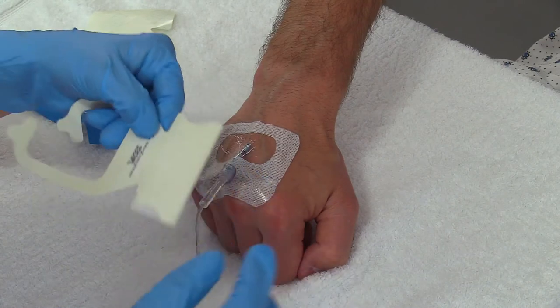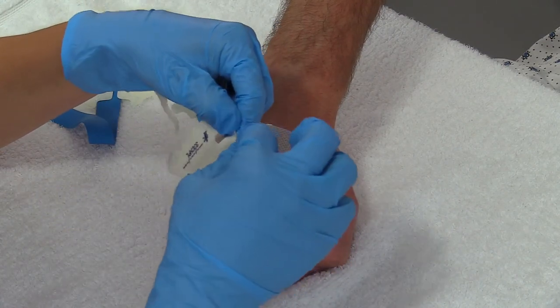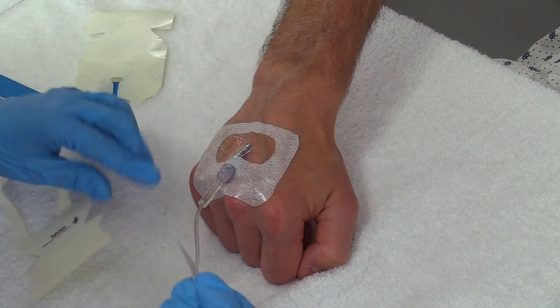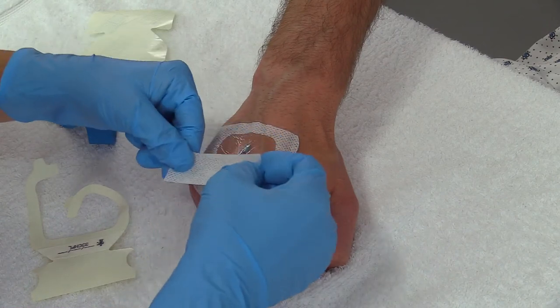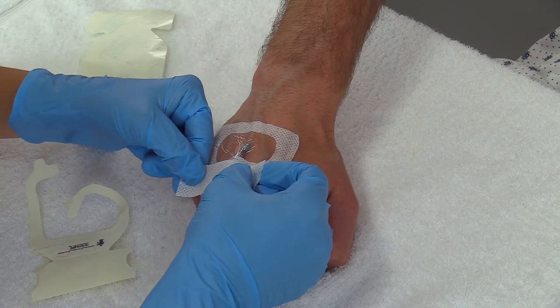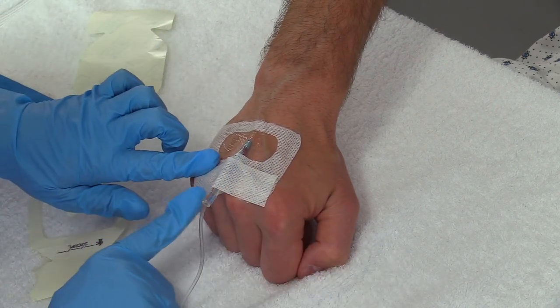Then I want to take this part of the tape — this big piece — and lay it across this part. It just provides extra securement. I'm applying pressure and sealing it down. Nice and sealed.